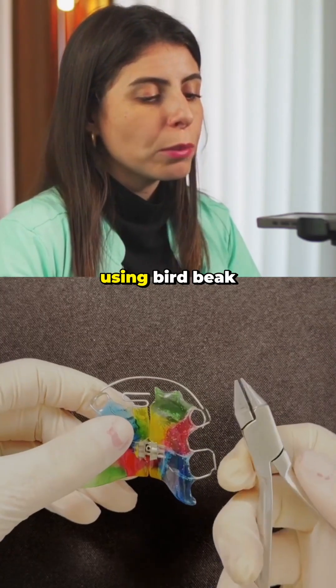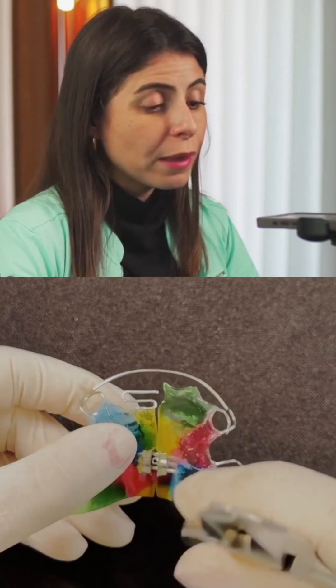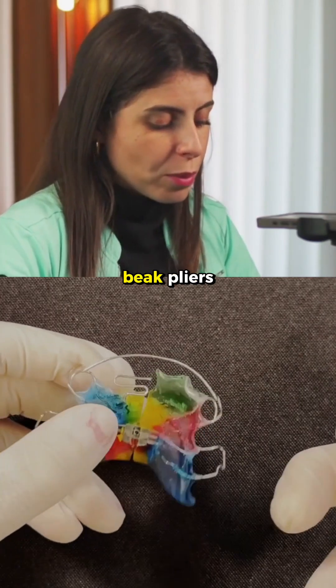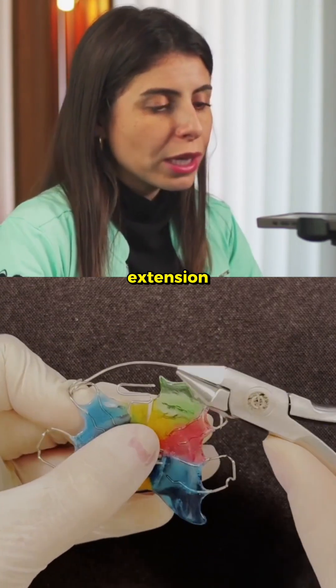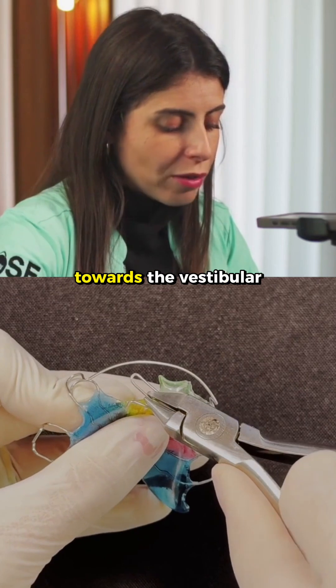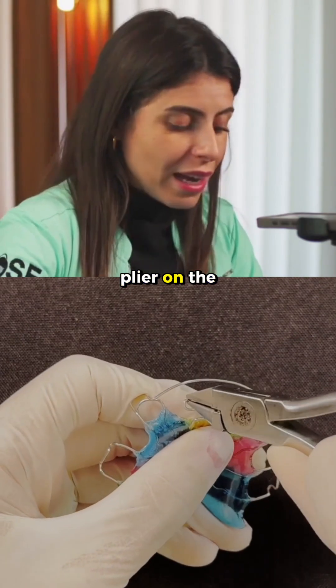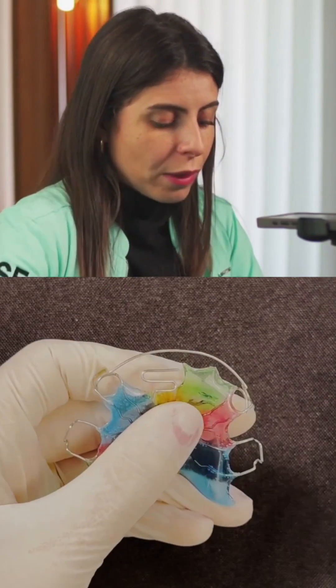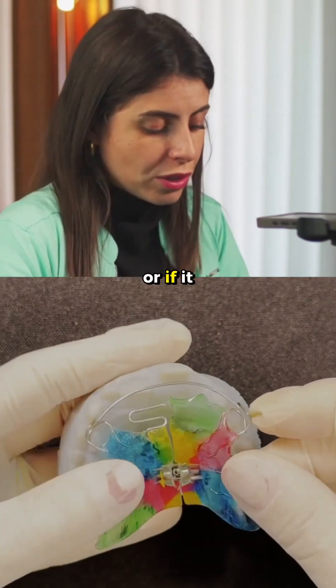Begin the activation using bird beak pliers or a 139-plier. With the rounded part of the bird beak pliers, start the activation at the beginning of the S-Spring extension, applying gentle pressure toward the vestibular arch. Next, place the rounded tip of the plier on the second extension. Now let's check if the activation was sufficient or if it was too much.